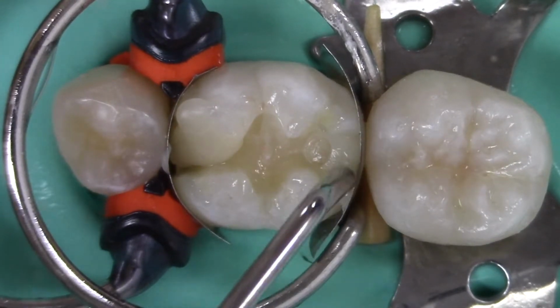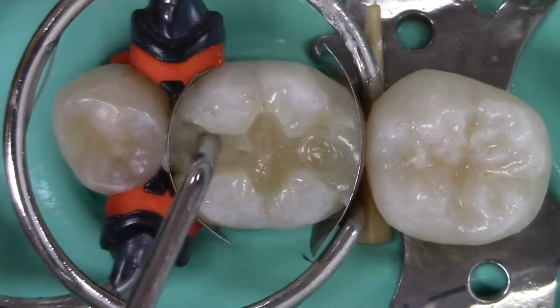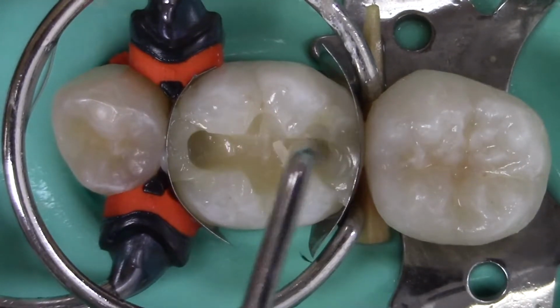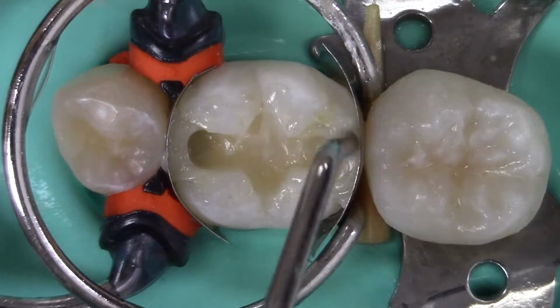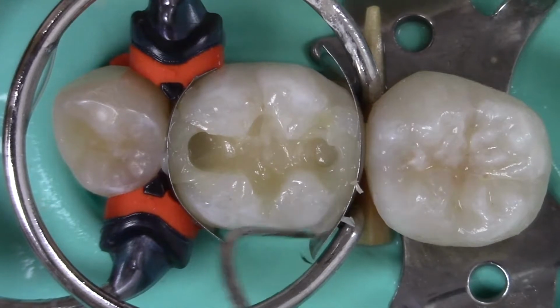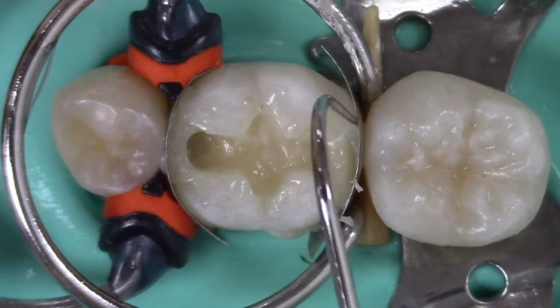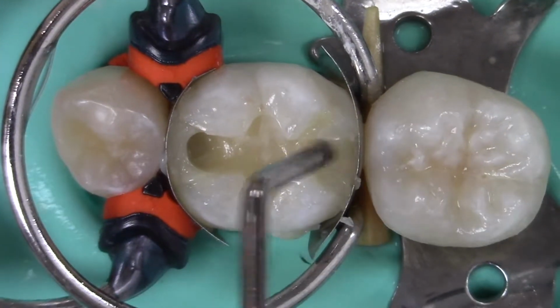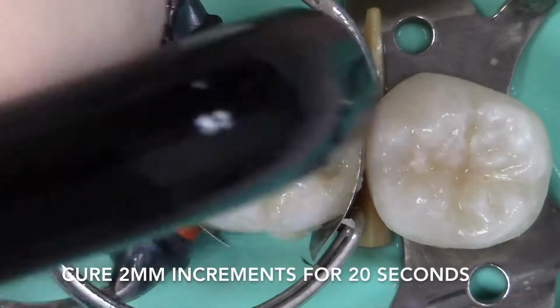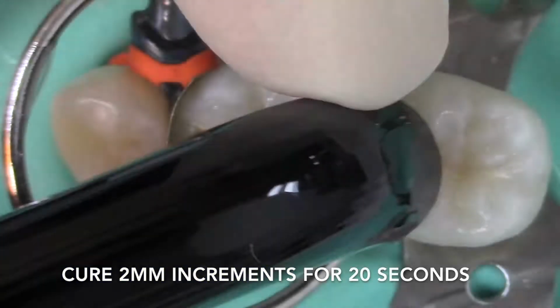The marginal ridge is formed by condensing the composite to make it even with the neighboring marginal ridges. Then the composite is pushed against the matrix, rolling up the composite and forming the marginal ridge. Finally, the ridge is contoured by running an explorer in the area of the occlusal embrasure. The composite is light cured in 2 mm increments for 20 seconds.